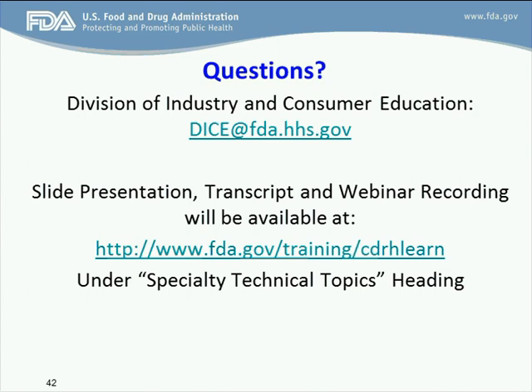In other words, are you going to have to do some kind of a calculation in which you anticipate for a reusable device that it may be used X amount of times over its useful life or under the warranty period or whatever parameter you choose to select, and then run a number of simulated use cycles that somehow relates to that number? So I believe this question, the number of cycles, would depend upon the complexity of the device and the specific features of the device. So this is a question that you should be asking the review division. They would be able to give you more guidance on that. Okay, thank you very much. I appreciate it.